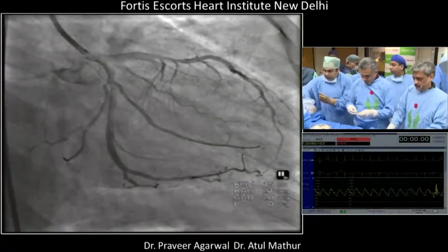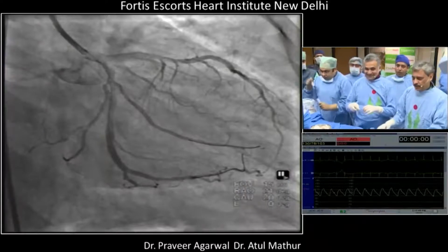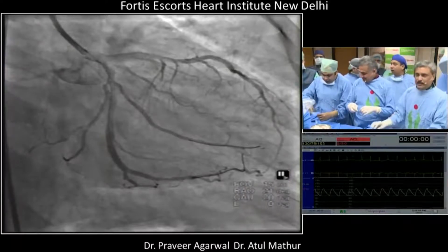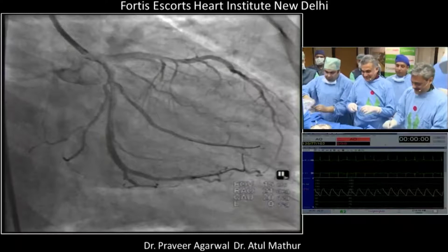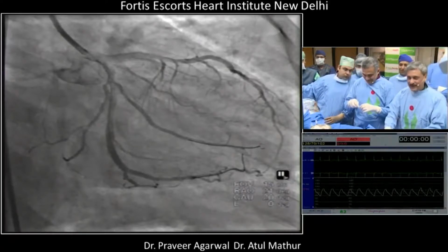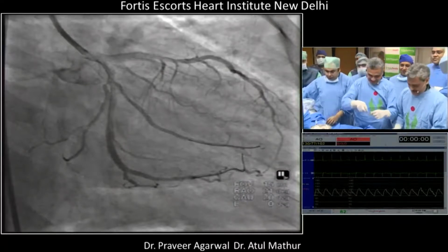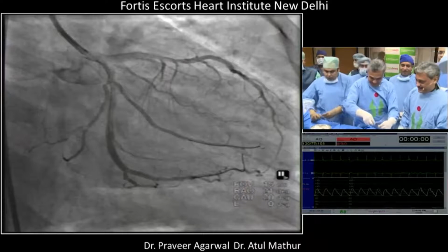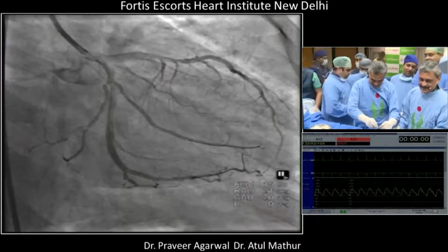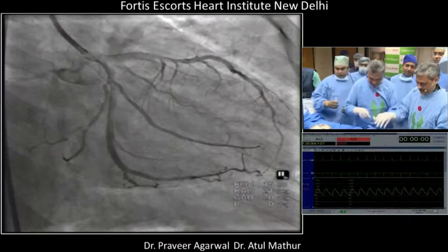Don't change your practice. No, it's still good to keep you on our side. Very politely nudging you on our side. Although you denied us a chance to show you a bifurcation stent, we would have loved to see it. I was going to ask you if the side branch would have been bigger. OM, interesting, but it'll be too small.